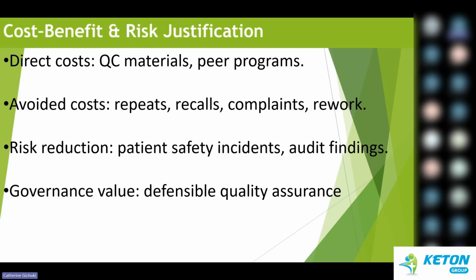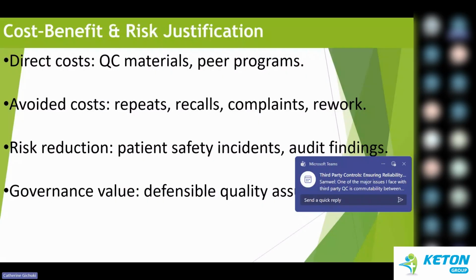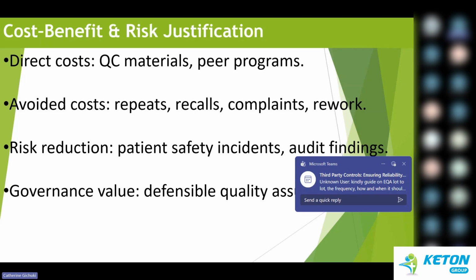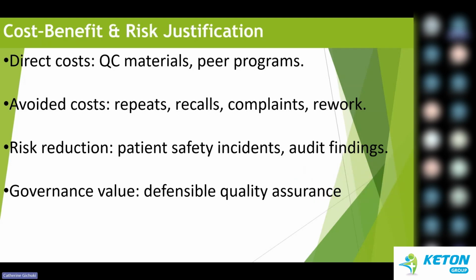So the cost of a strong QC is far lower than the cost of errors and recalls and patient harm and patient safety and all those audits.